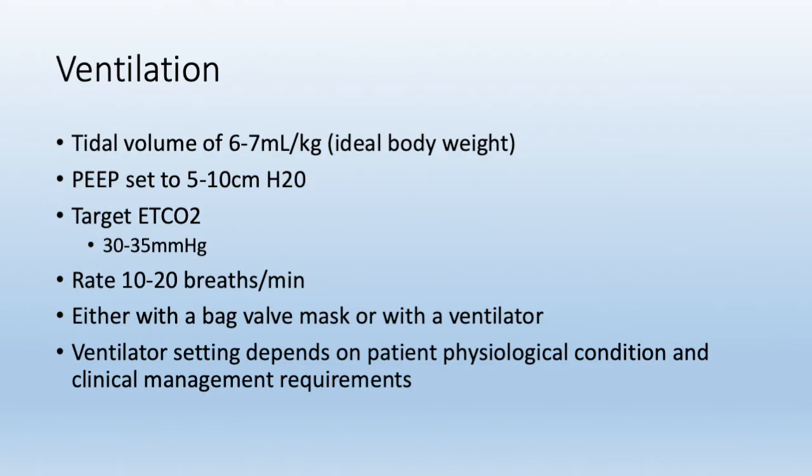So if you have a ventilator in your service, lucky. If you're going to use one of them, obviously there's a lot of different settings that are available on these things, so titrate it to your patient and also as your service requires. We don't have them in Queensland, so I don't know a great deal about them.